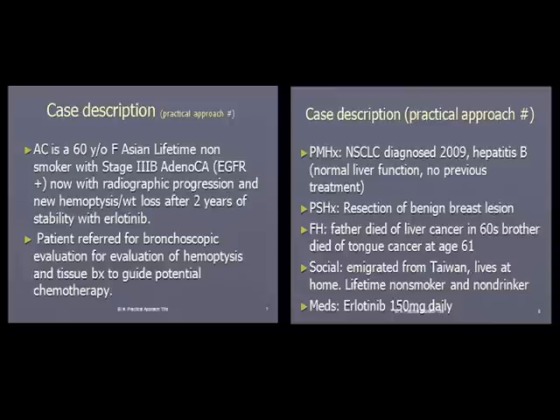In the current example, we describe a 60-year-old non-smoking female with lung adenocarcinoma which has progressed on therapy. She was referred for repeat bronchoscopy and biopsy to guide chemotherapy options. Relevant medical, social, and family history are then briefly reviewed.